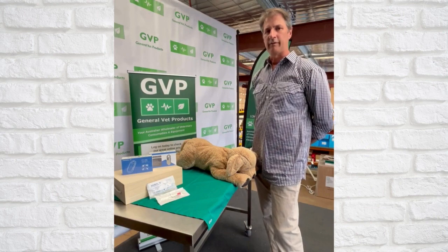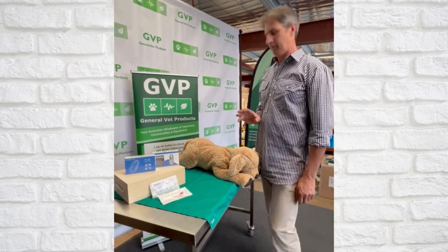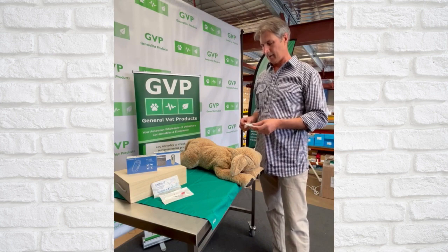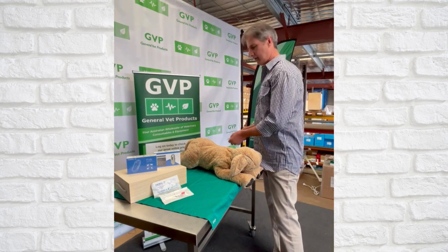Hi everyone, Pete Vet from GVP, General Vet Products. We sell a lot of microchips — tens of thousands of microchips over the last few years. Through COVID obviously with all the puppies it was huge, and it's certainly slowed down, but I still wanted to show you a little bit about our microchips.